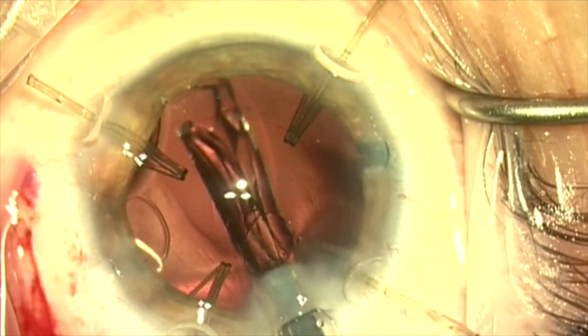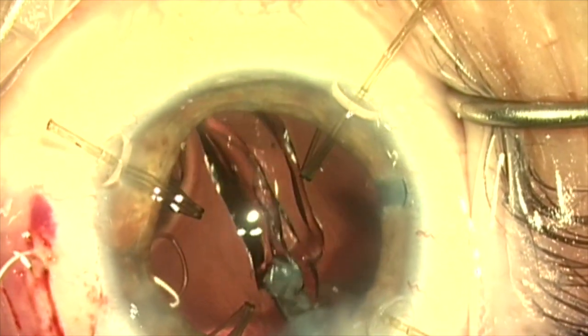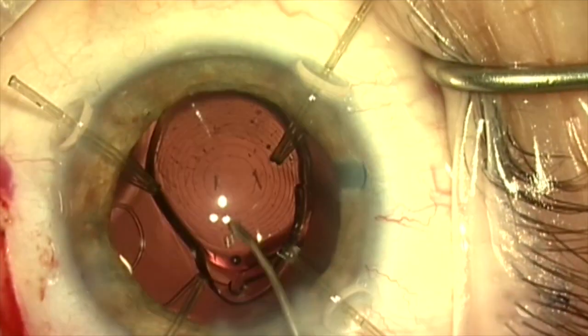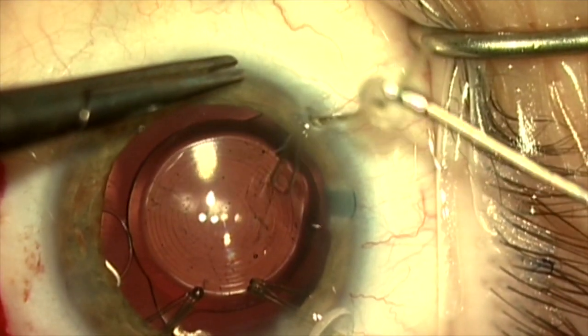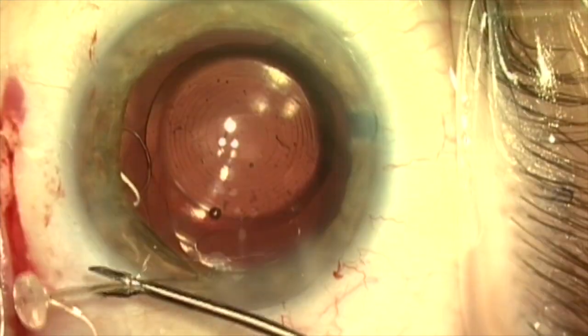Now the capsule retractors are going to stabilize the capsular bag as I inject the single-piece Symphony lens. This gets tucked into the capsular bag. Once the lens is in place, I'm going to go ahead and remove the capsule retractors because I don't need them anymore.